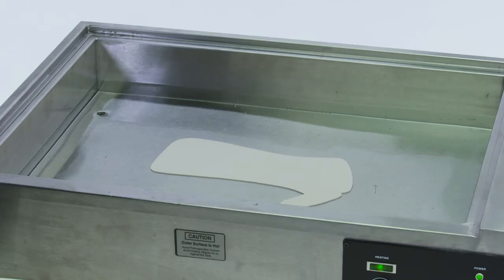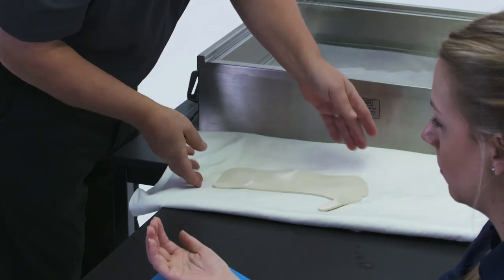Heat entire splint for 1 minute. Remove the splint and dry both sides on a towel.